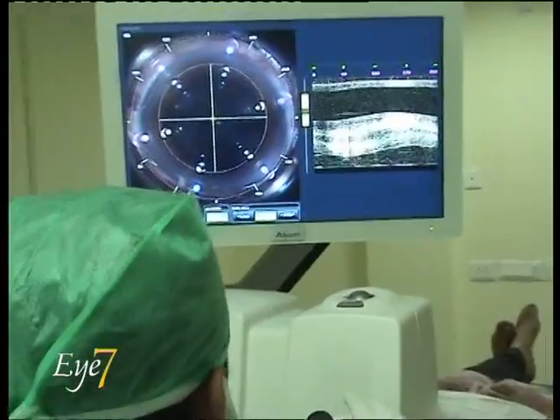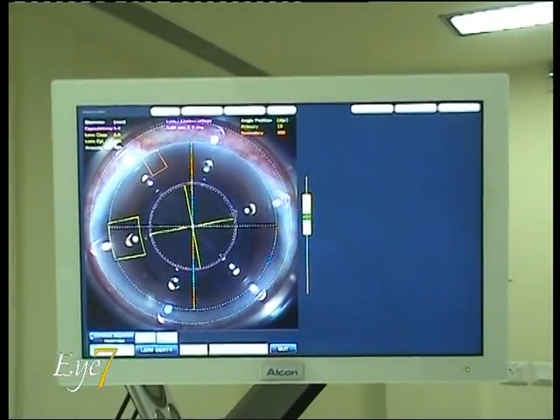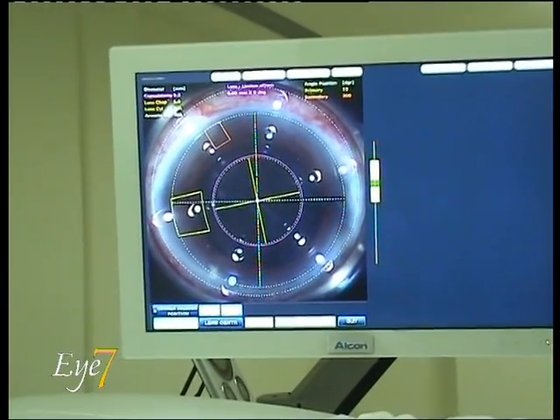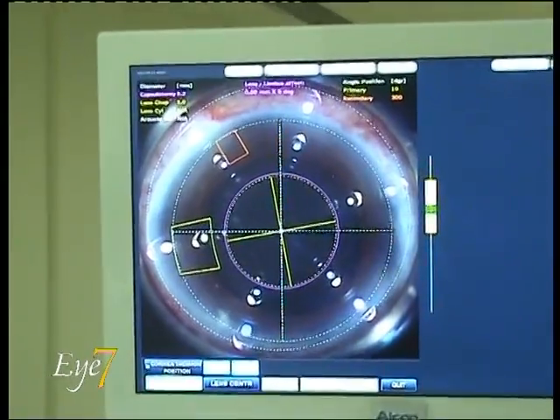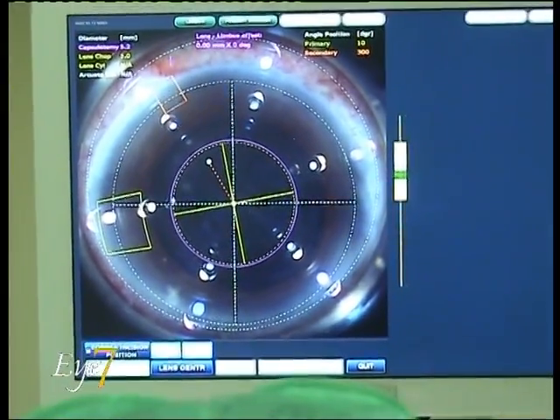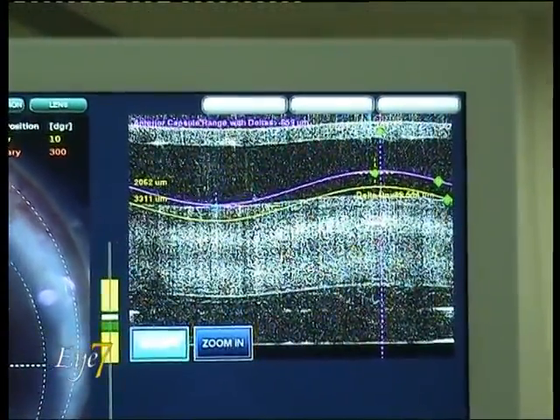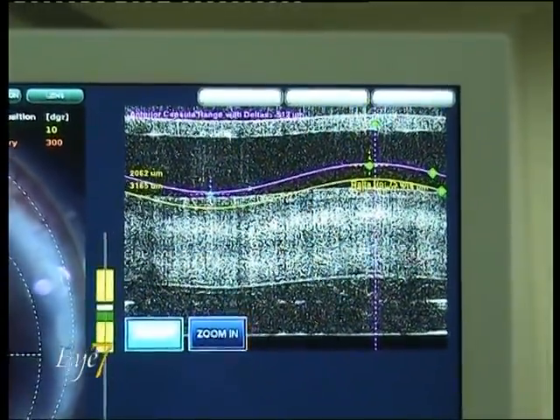The docking is complete, and as soon as the laser docks, the machine starts picking up live images of the eye. Once we are ready, we start marking the points on the eye. Here we are marking the centration of the laser on the eye, which in technical terms is called the limbus marking, and then marking the incisions, and then we come to the anterior capsule marking.